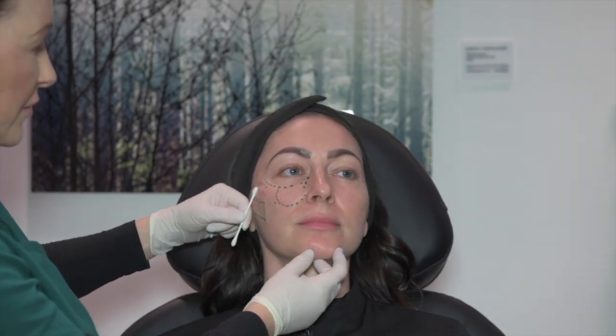If we assess the lift, can I get you lift camera? We can already see some lifting effect on the jowl, a slight eversion of the lip. Nasolabial fold looks slightly improved. Then we're going to move to CK4.